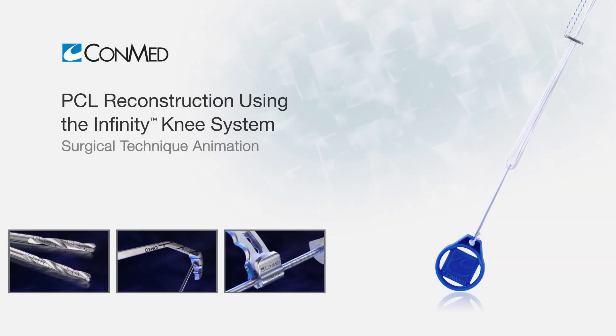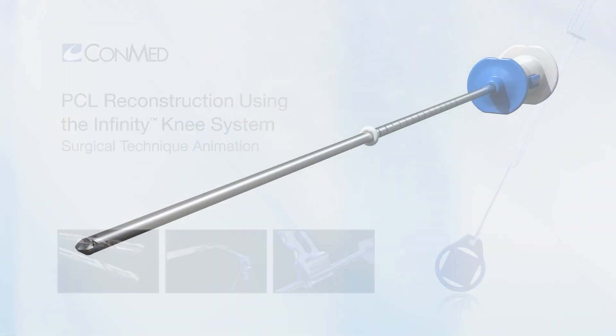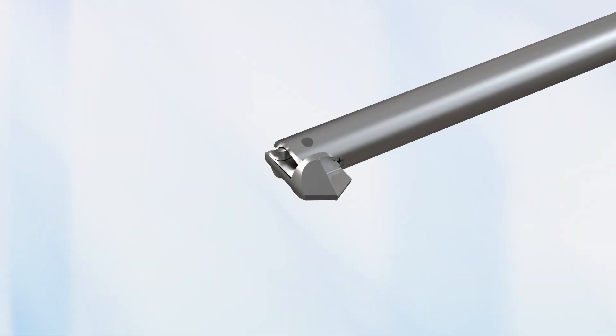The Infinity Knee System is a modular platform for PCL reconstruction that supports a variety of surgical approaches, reaming, and fixation preferences.